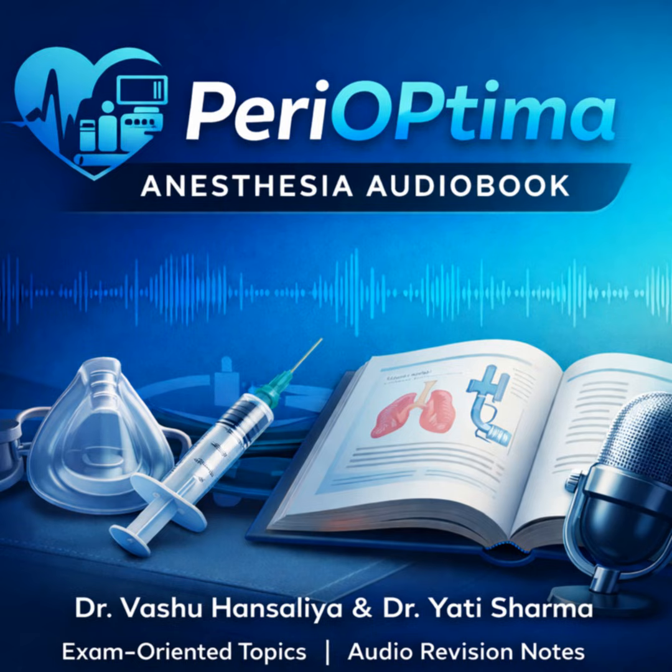Lastly, availability. DL is cheap, it's everywhere, it's durable. VL has a much higher initial cost for the device and monitor, requires maintenance, and often uses expensive single-use blades, which adds up. And to recap, for C-spine immobilization, DL is associated with more C-spine motion. VL is strongly preferred because it's proven to cause less movement.